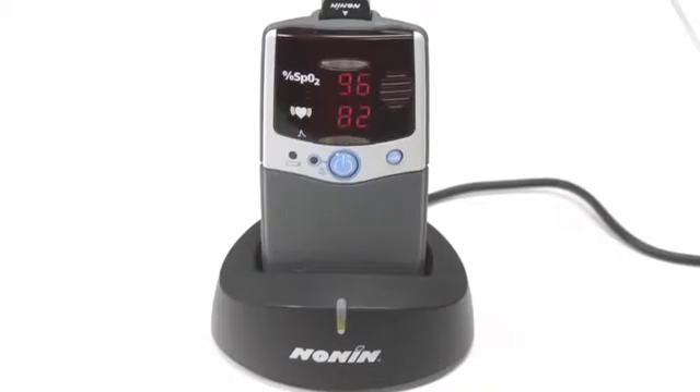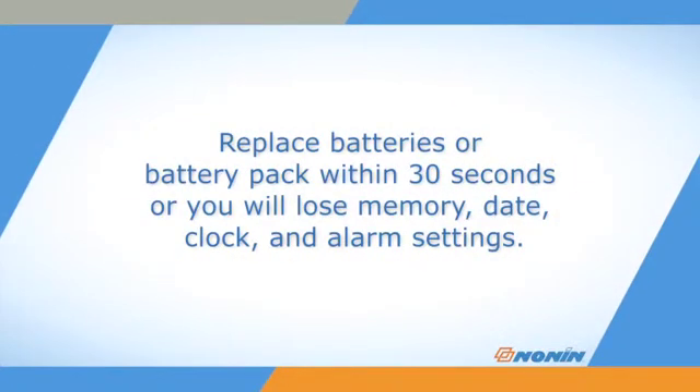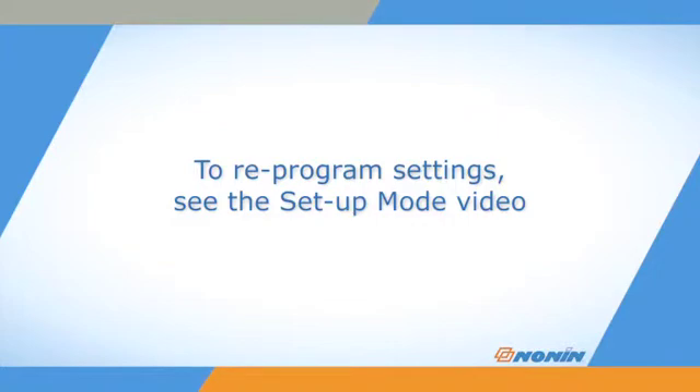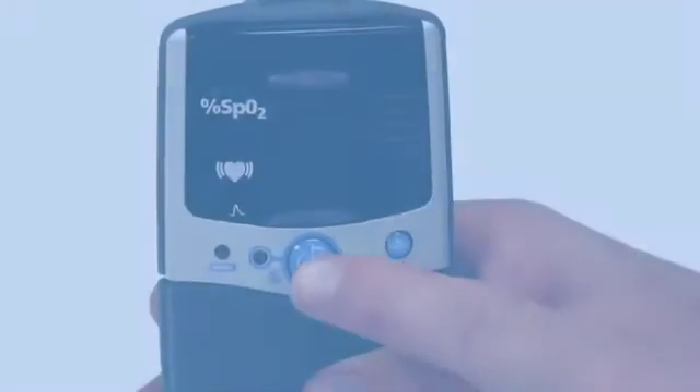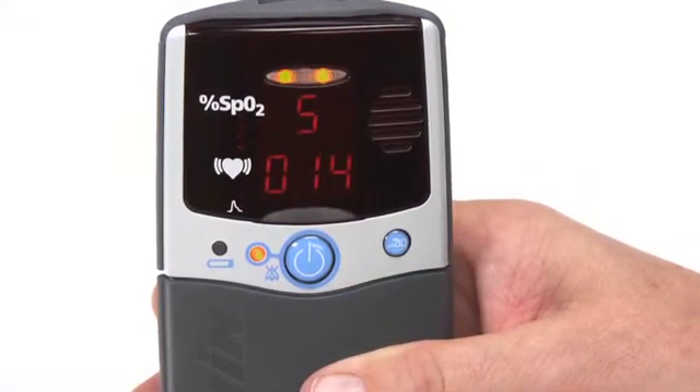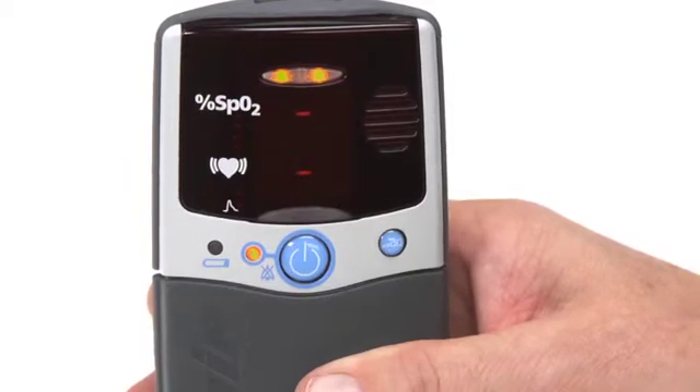Replace the batteries within 30 seconds to retain the clock, date, and alarm settings, as well as any stored patient monitoring data. These items may be lost if the unit does not have any power supply for over 30 seconds. If you lose the settings and stored data, you can reprogram the settings using the setup mode described in the 2500/2500A setup video. If the oximeter has had regular battery changes or recharges, the settings should be retained for its next use.